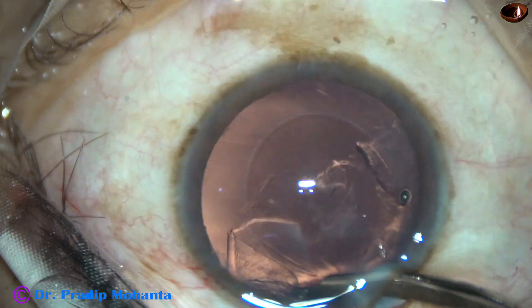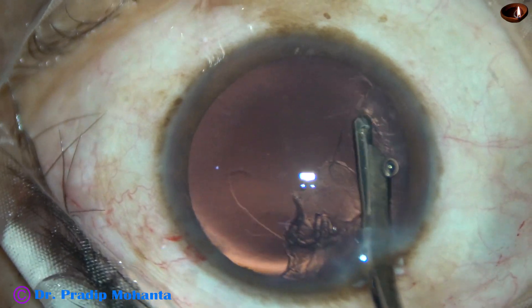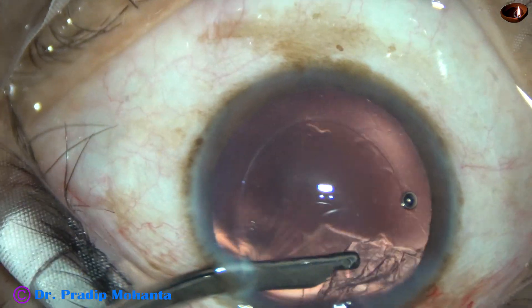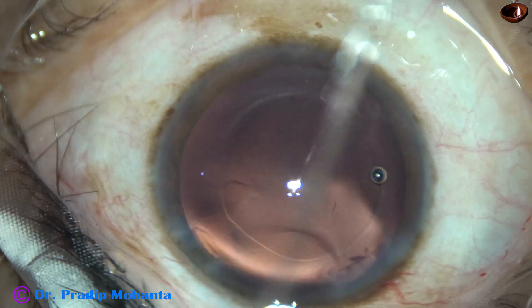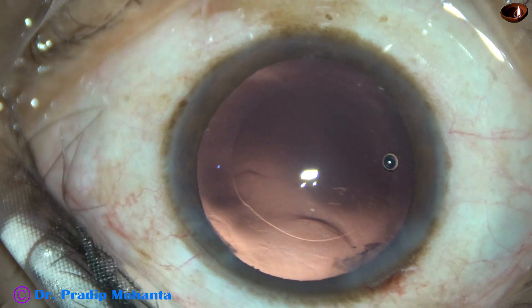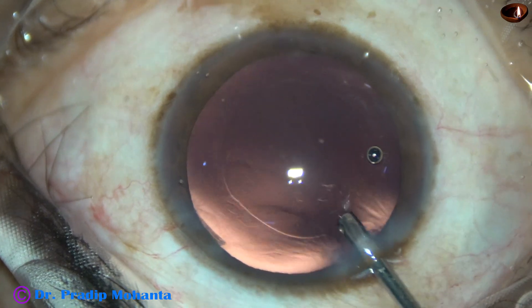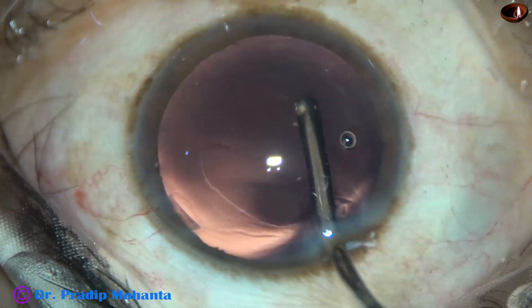I am using the Simcoe. Simcoe is very gentle; you can keep the IOP on the lower side and aspirate the cortical matter. By manual irrigation and aspiration, you can keep more irrigation and the flow may be more. In this case there was only one side port, so I used this instrument. The nucleus management is done.